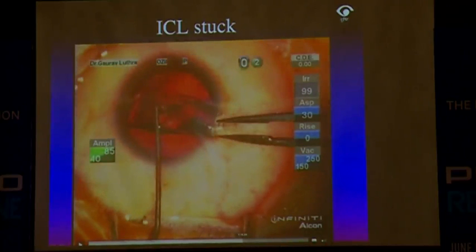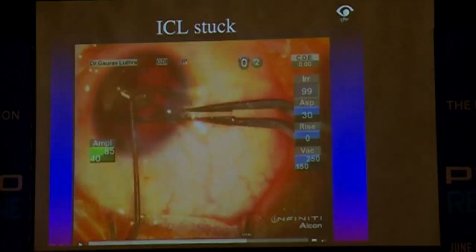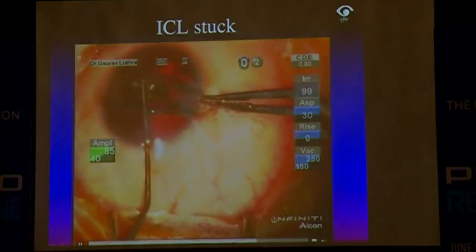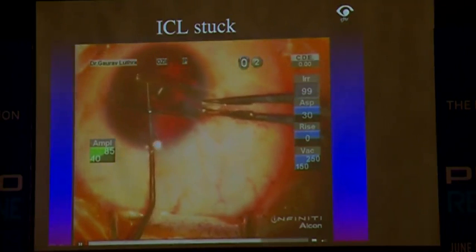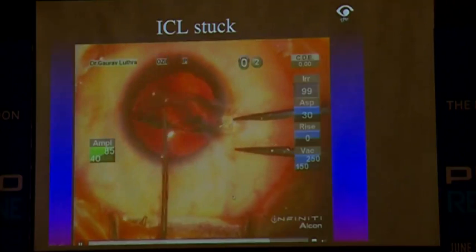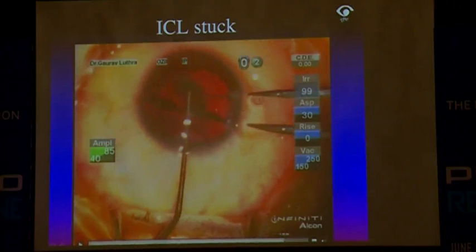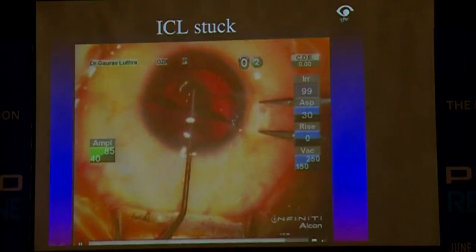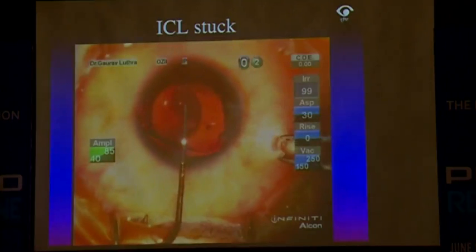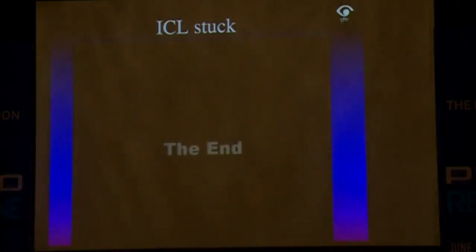Somehow, half expecting that I'd have to explant this lens, and most of the time you don't have a replacement lens either, and you don't want to be doing this. You don't want it to be manipulated with any kind of manipulator inside, because you can scratch the optic. Once your lens is in, of course you can handle it. The best thing is never to be stuck in such a situation. If you take care of the few things I told you about wound-assisted injection, having good counter pressure and adequate incision size, you will probably never get into this situation at all.